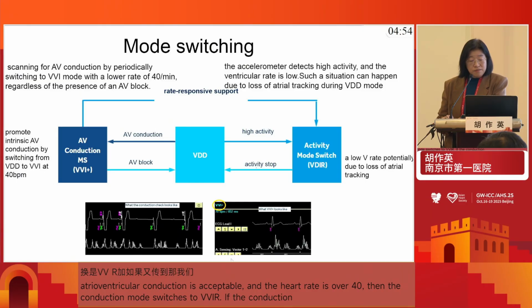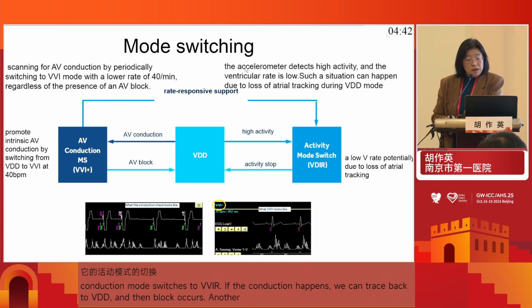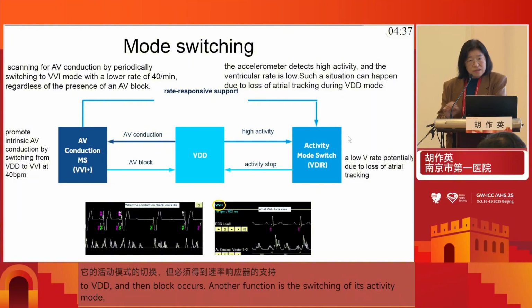And another function is the activity mode switch, but it must support rate response. Supposed that it is about the external sensor detecting high activity.